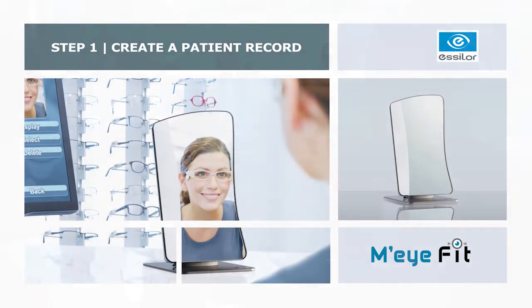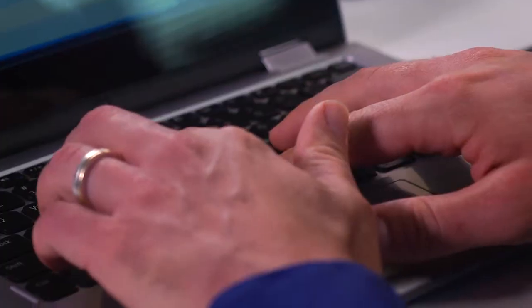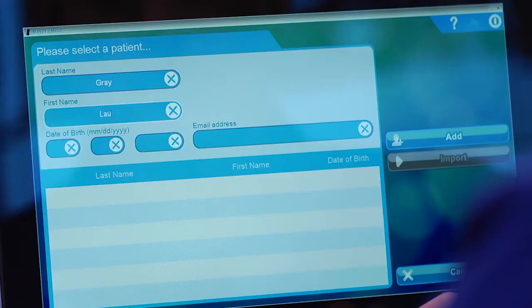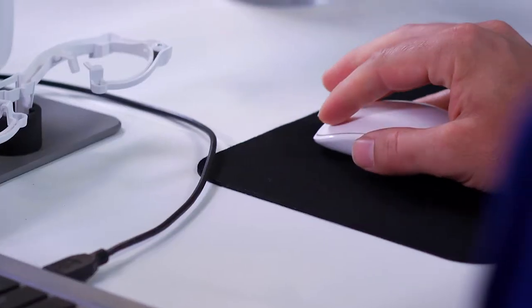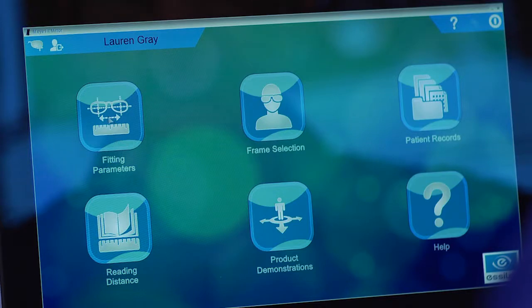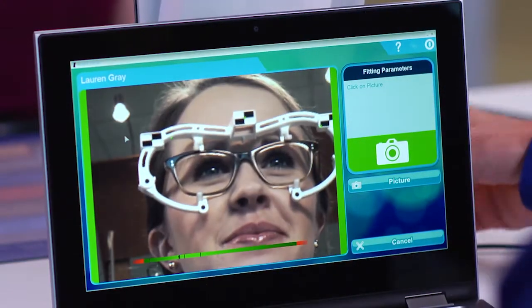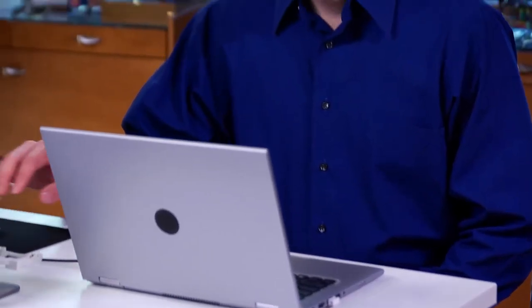To create a patient record, click on the patient icon with the plus sign in the upper left corner of the screen. Enter the patient's first and last name. Click on the add icon to save your information and return to the home page. Once you return to the home page, the fitting settings and options for selecting the frame are no longer grayed out. Click on the fitting parameters icon to begin taking the measurements.